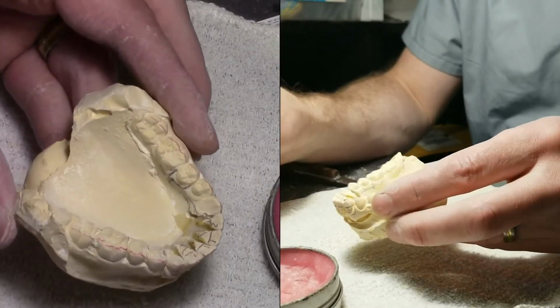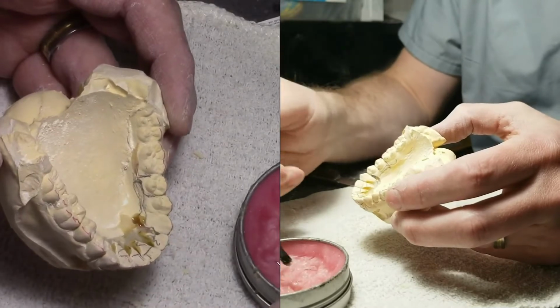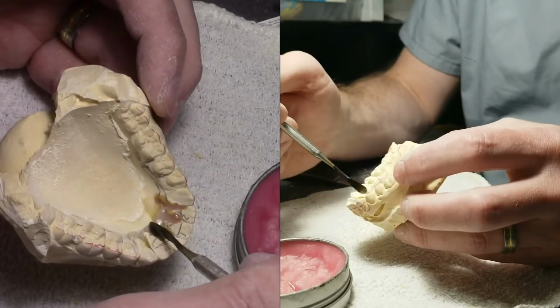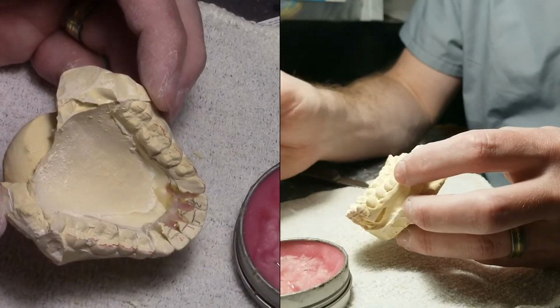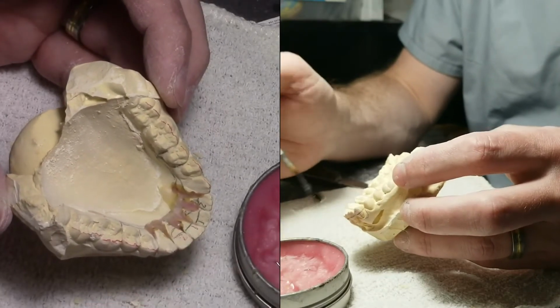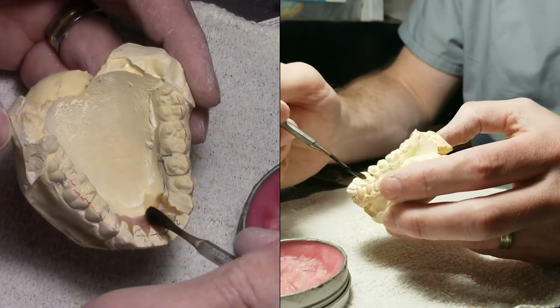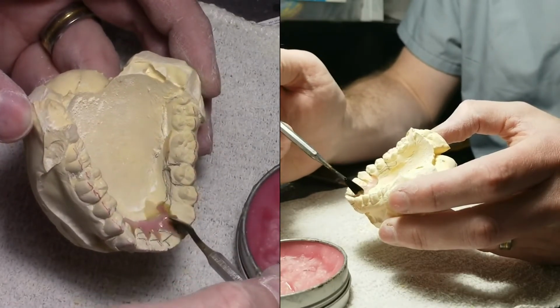I'm going to get my pink wax going. So I like this pink wax. It's a good all-weather one. It's not too stiff. It has a little bit of mobility. It's got a good carvability. Of course, the utility wax is very mobile, very easy to move teeth in. So when I'm getting them pretty close to where I want them, I use this pink wax, which will allow for smaller movements, but yet hold everything in place.